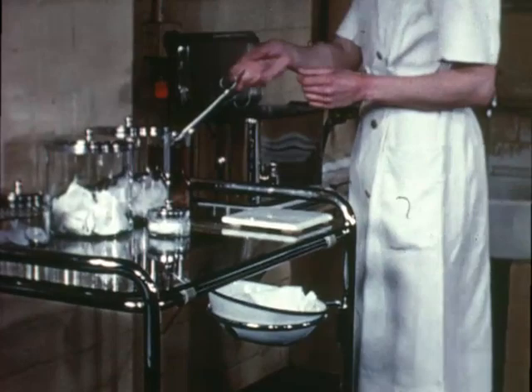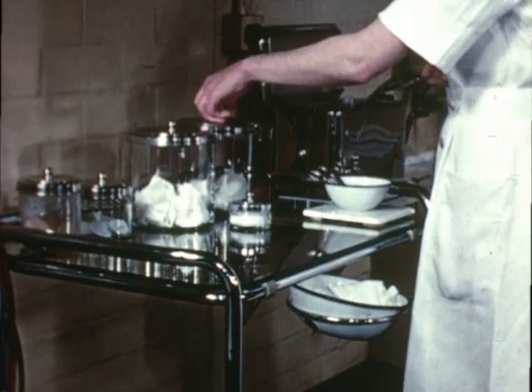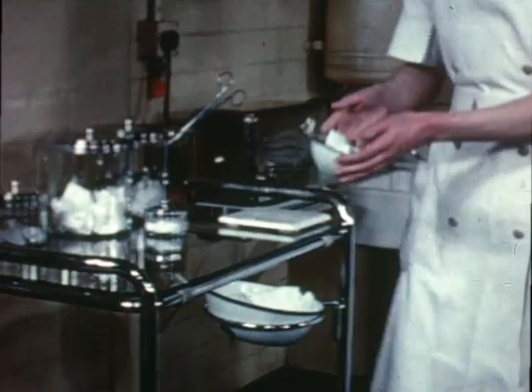She collects the dressing material into a sterile bowl: two pairs of dressing forceps, dry wool, mops ready-moistened with the cleansing solution, and plenty of dry gauze. The clean material is kept in lidded jars so that no dust can fall on it.